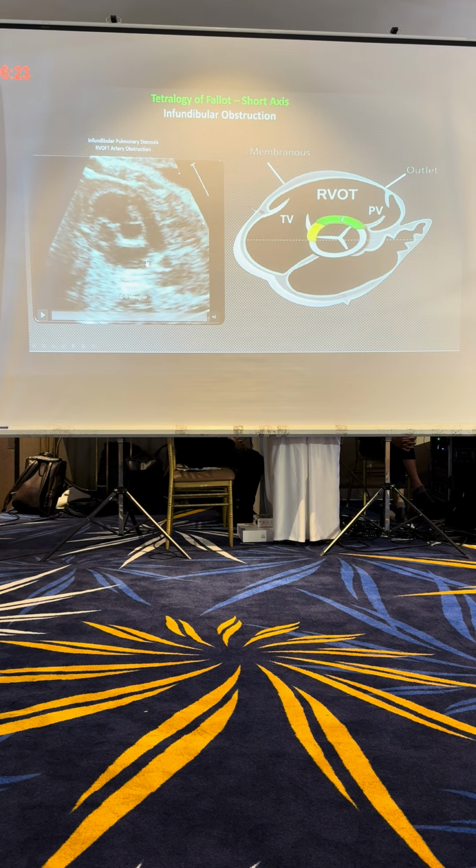You asked me today the question, Simon, when do I look at the short axis? This is an example where I have to look at the short axis. This is the tricuspid valve. This is the Mercedes-Benz of the aorta, and this is the pulmonary valve, and this is the right ventricle. This is the view you want to get in every baby with tetralogy of Fallot, because you want to work out, is there a band of muscle that's extending and obstructing the right ventricular outflow tract?